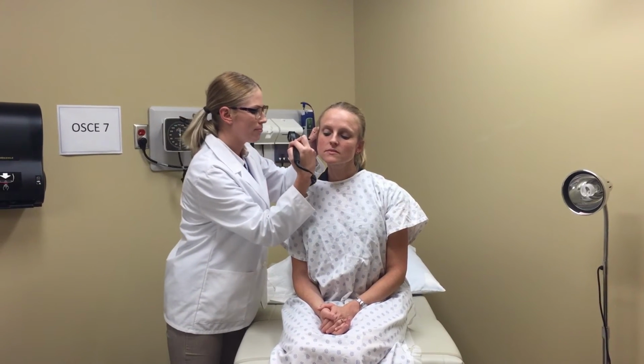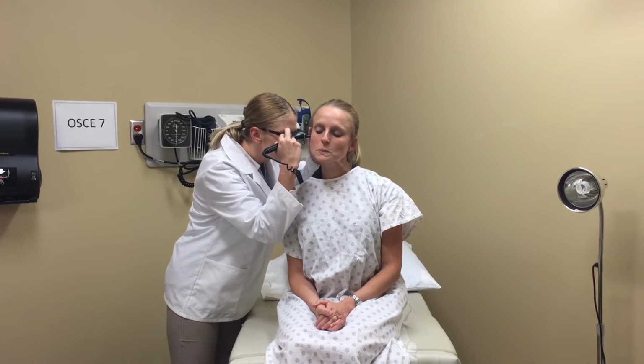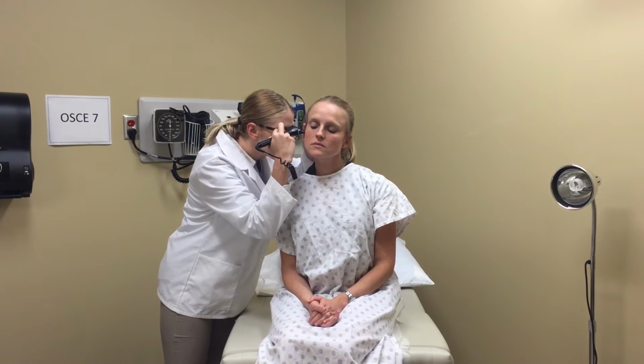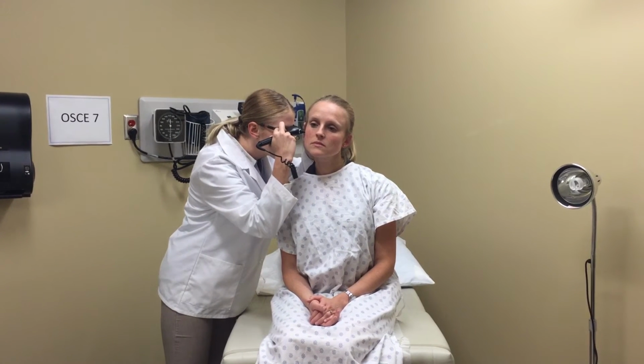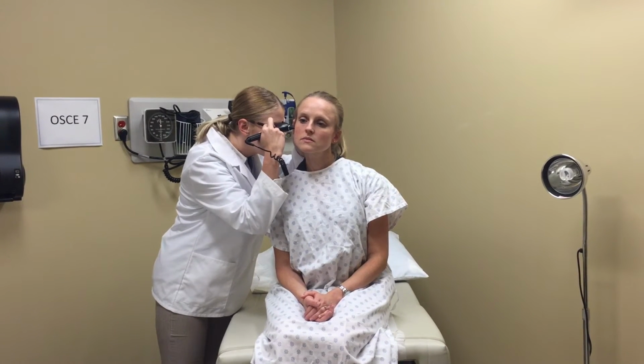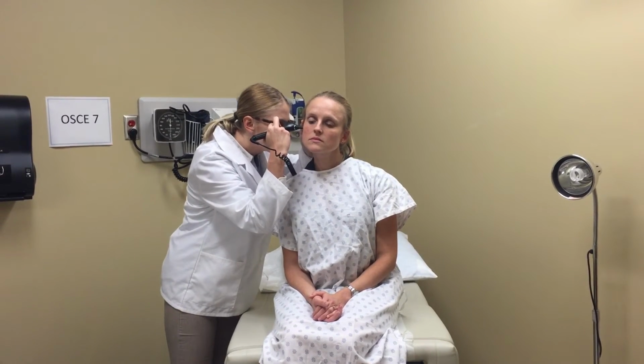The final part of the ear exam is visualization of the tympanic membrane using the otoscope. Hold the otoscope like a pencil and use the patient's head as a fulcrum. Pull the patient's auricle up and back. Insert the otoscope, noting any bleeding or discharge in the external auditory canal. Stop when you can visualize the tympanic membrane, which should be pearly gray and without holes or excessive redness. Also note the cone of light, manubrium, umbo, pars tensa, and pars flaccida. This will be performed bilaterally.